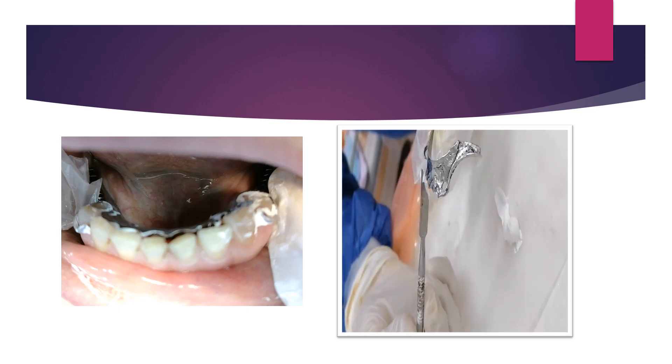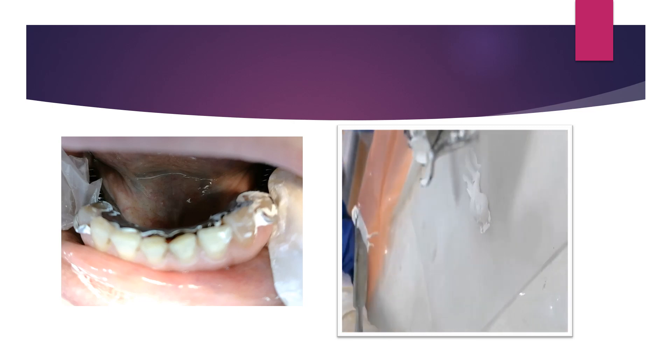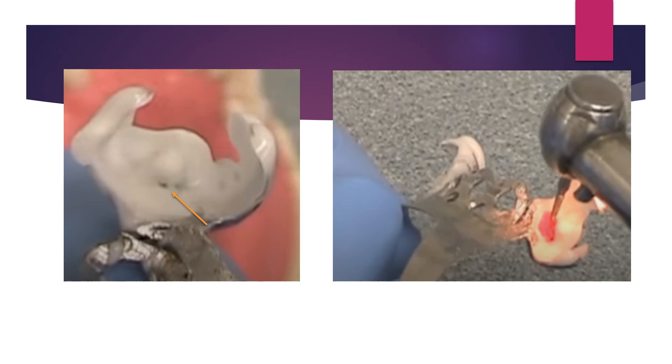Between the major connector and the rests and rest seat preparation, apply pressure indicating paste to identify the high points or pressure areas preventing seating of the framework. Apply it on the major connector, the clasps, and the rests, then do insertion and seating while pressing at the rest locations. Remove the framework — the pressure areas will appear as zones not covered by the paste.